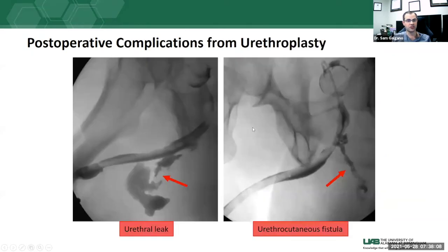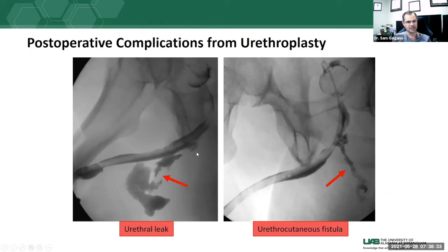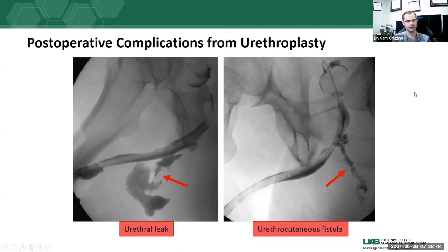Here are examples of what the post-operative urethroplasty should NOT look like. On one urethrogram, there is significant contrast extravasation down into the pelvis and perineum — a urethral leak not extending to the skin surface. In another case, during the procedure the patient noted fluid coming out, which was a urethrocutaneous fistula. Both show clear extraluminal contrast. Typically before re-operation, the Foley catheter is left in for an extended period to see if it will heal on its own.